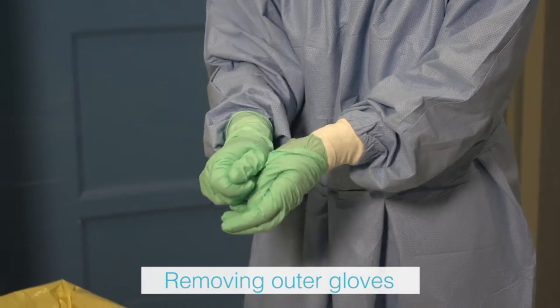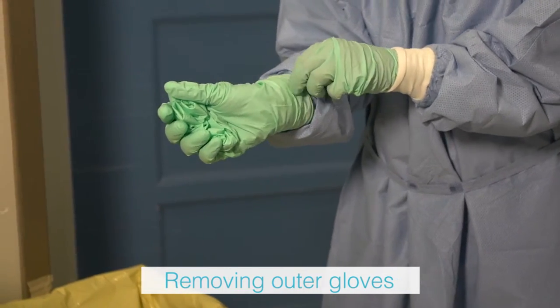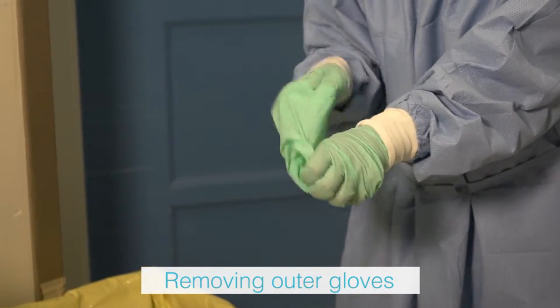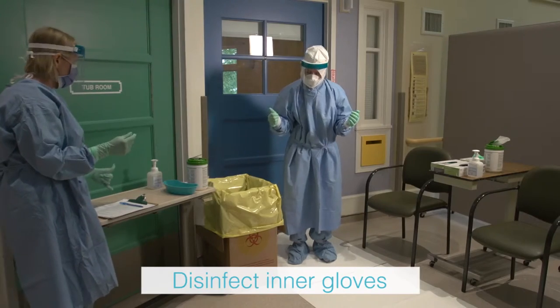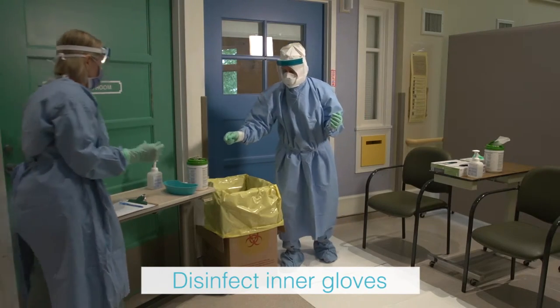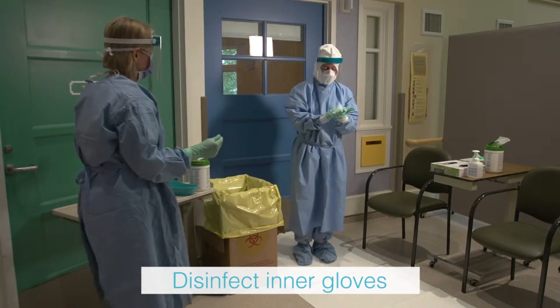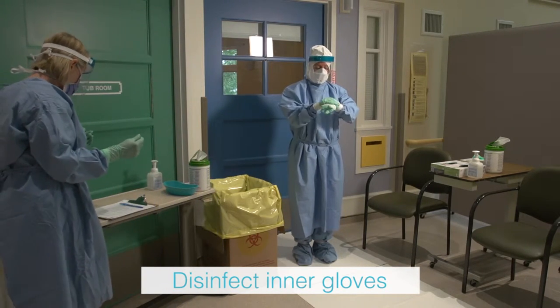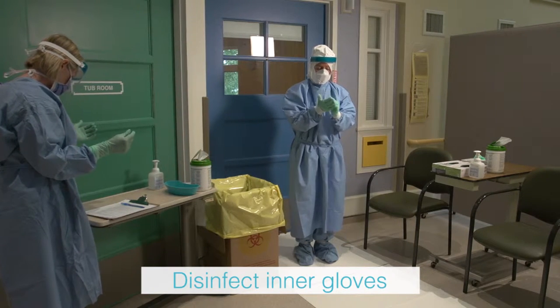The health care provider removes the outer glove carefully to minimize contact with the inner glove. Grasp the outside edge of the glove near the wrist and peel away, rolling the glove inside out. Slide one or two fingers under the wrist of the remaining glove and peel away. Place gloves in the waste receptacle. The inner gloves are then cleaned using a disinfectant wipe and allowed to dry before proceeding.